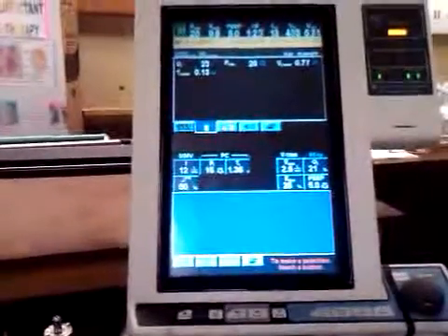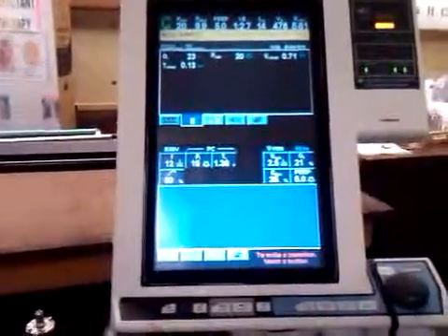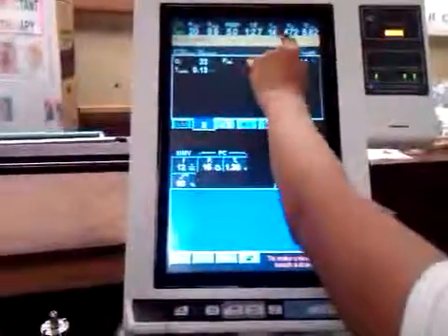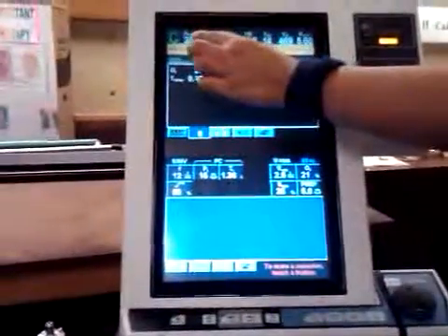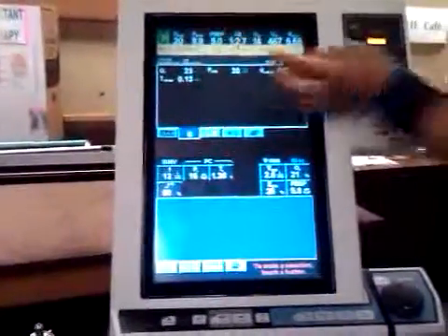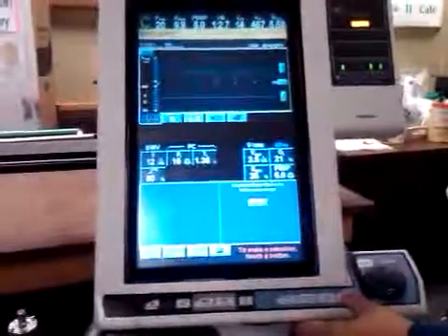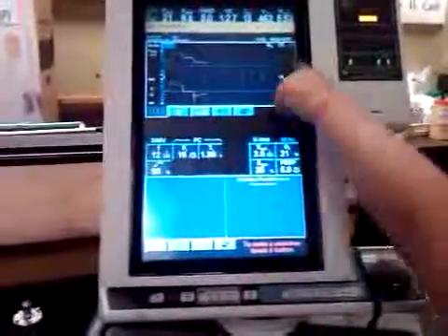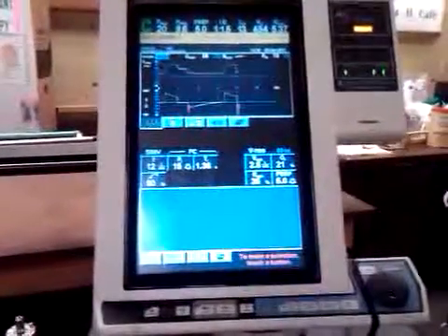What else do we need to get for SIMV? You just plug it in the box. And don't forget to get your frequency before that, and your minute volume to get your tidal volume. We got the P1, and I already showed them the plateau. Oh, and then the inspiratory pause for the plateau, to get the P2, right? So it's 21 and 13. P1, P2, do the math.